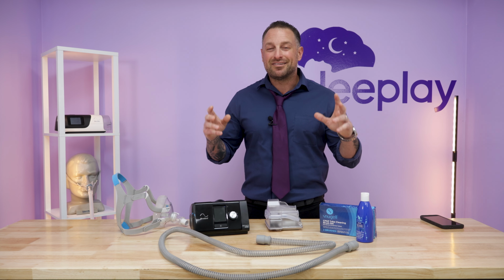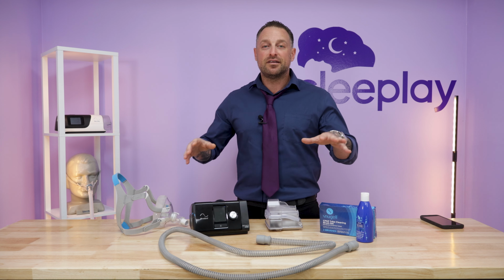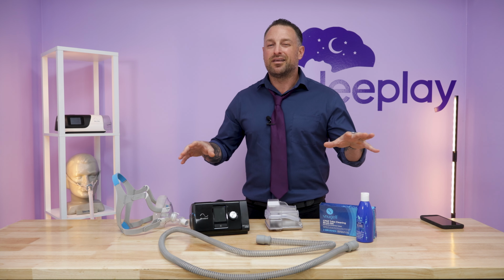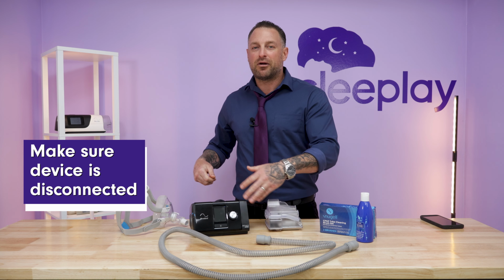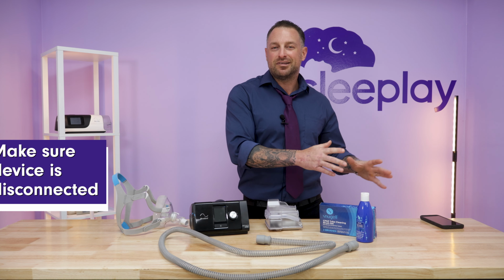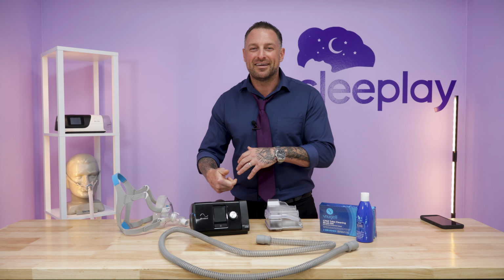Now make sure, I know this is kind of common sense, but if you're going to clean these things in water or with products, or anything wet around the machine, you want to separate the power cord from the machine, take the machine, set it aside, as well as if you are using heated tubing, please dry the end. Make sure it's dried thoroughly. I know you can't clean the inside or dry the inside of the tube 100%, but you can dry that little chip that's going to connect on the back of the machine, okay?